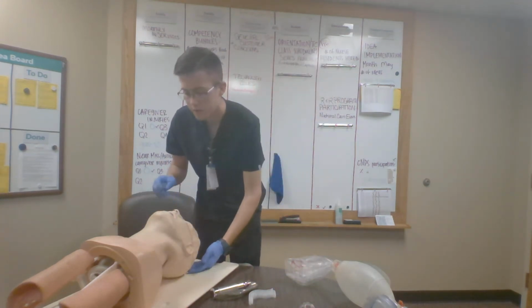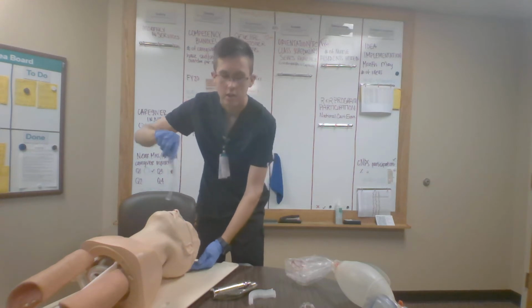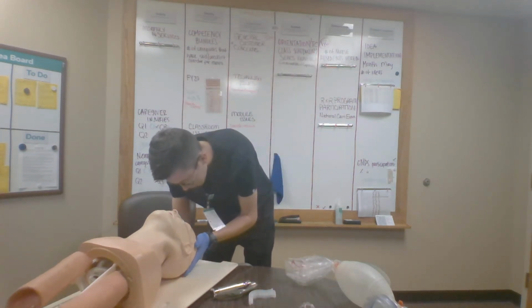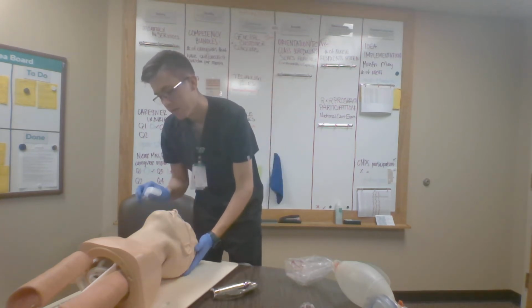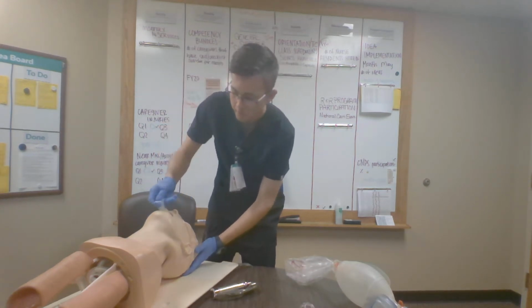If there are secretions, then I'm going to take my rigid tip catheter, insert, cover the suction port, suction for no longer than 10 seconds, and only suction on my way out, reevaluate the airway, make sure that the airway is clear, and then after I have determined that, I will take my OPA and measure, make sure that it is a properly fitting OPA.